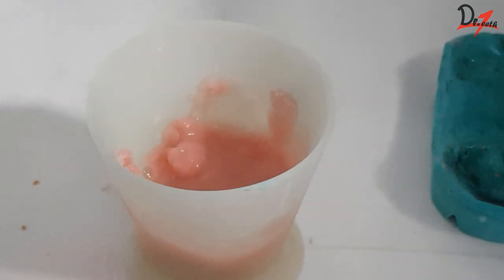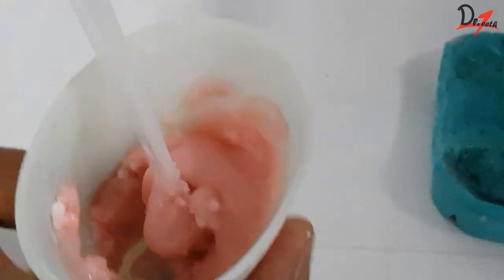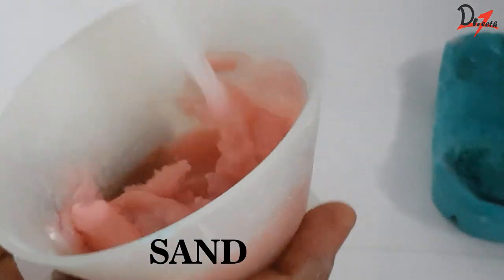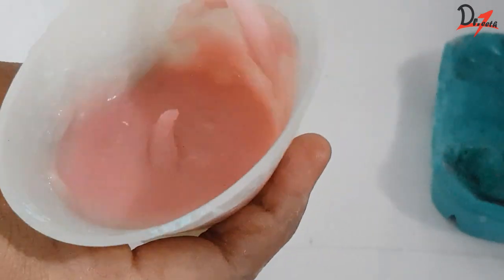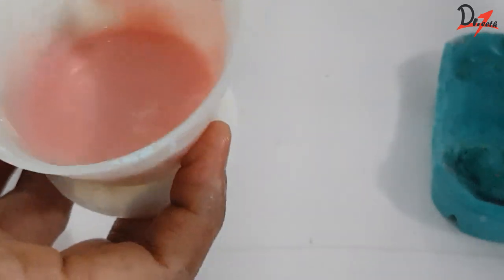Then we will add powder to the liquid and mix it properly. The first stage resembles sand in water — that is why it is called the sandy stage. Just have a look at its consistency. Can you feel that sand-in-water effect? That is why it is called the sandy stage.